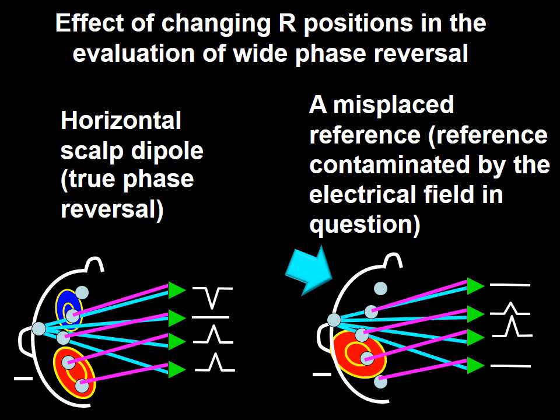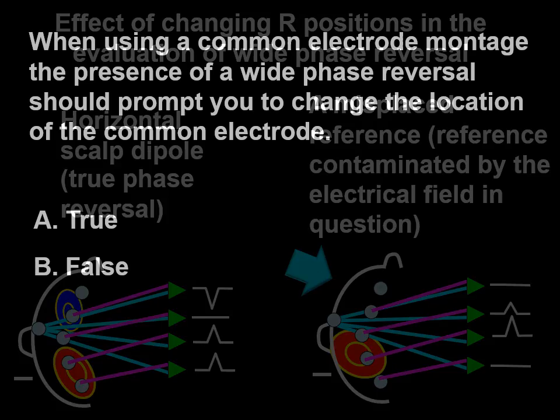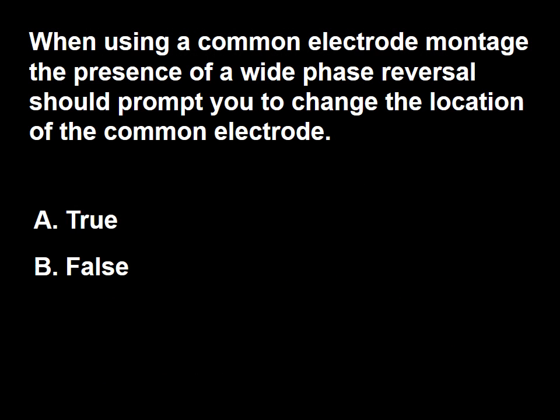The problem is that this is contingent on you changing the reference electrode to the right place, that is, to a neutral place. So the answer to this question is true.